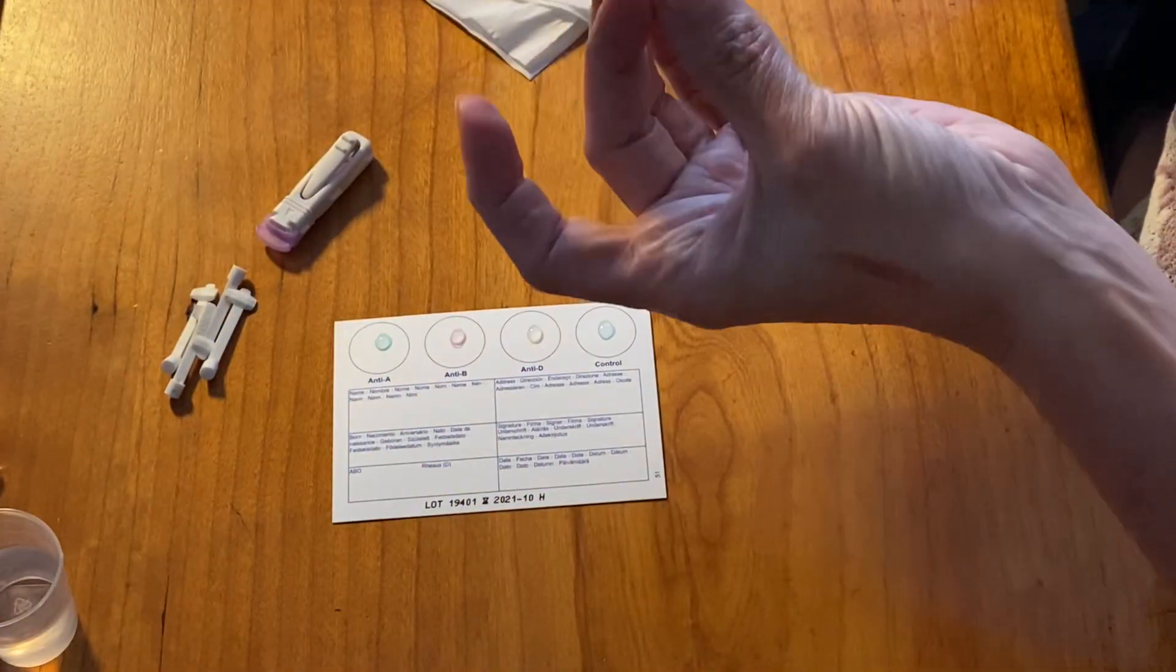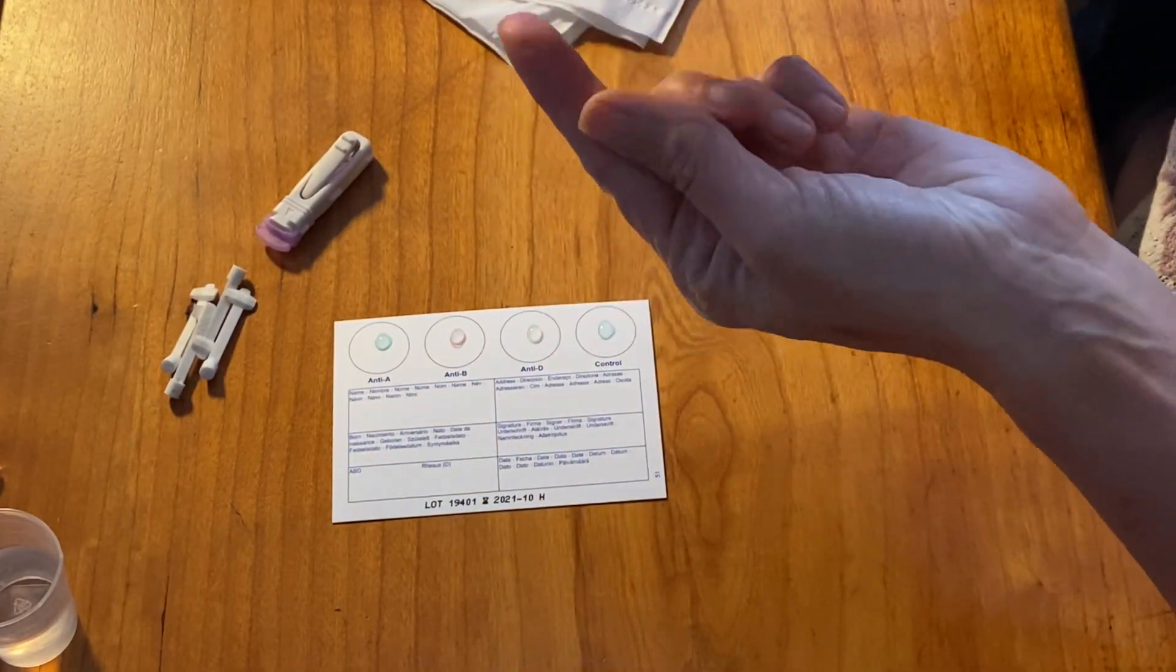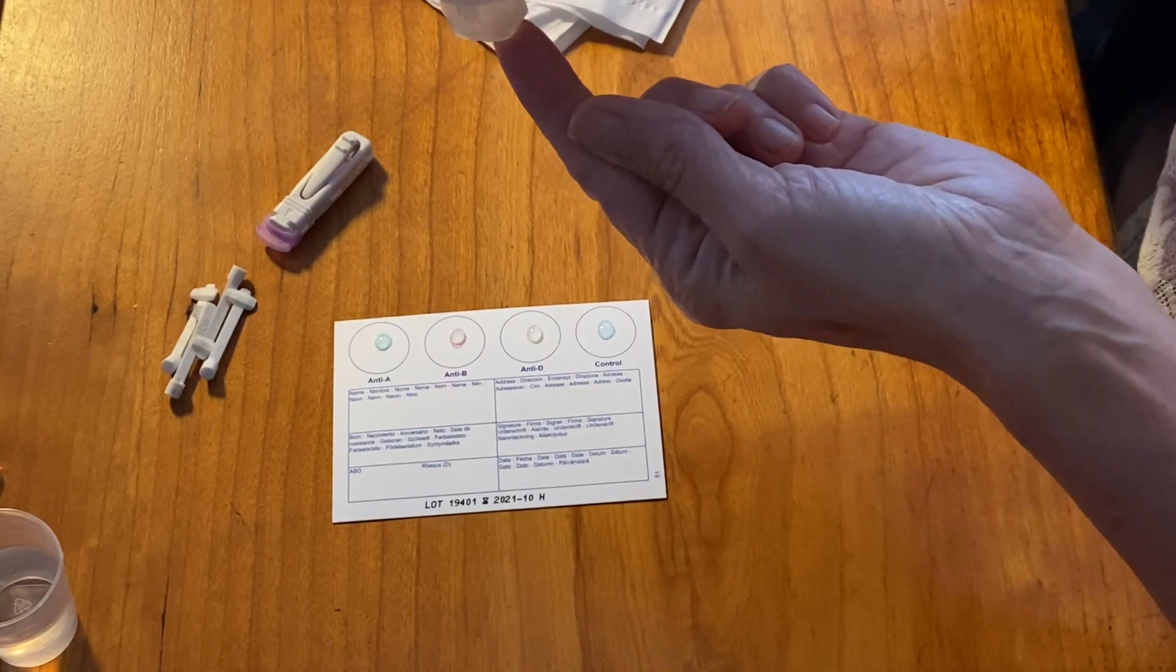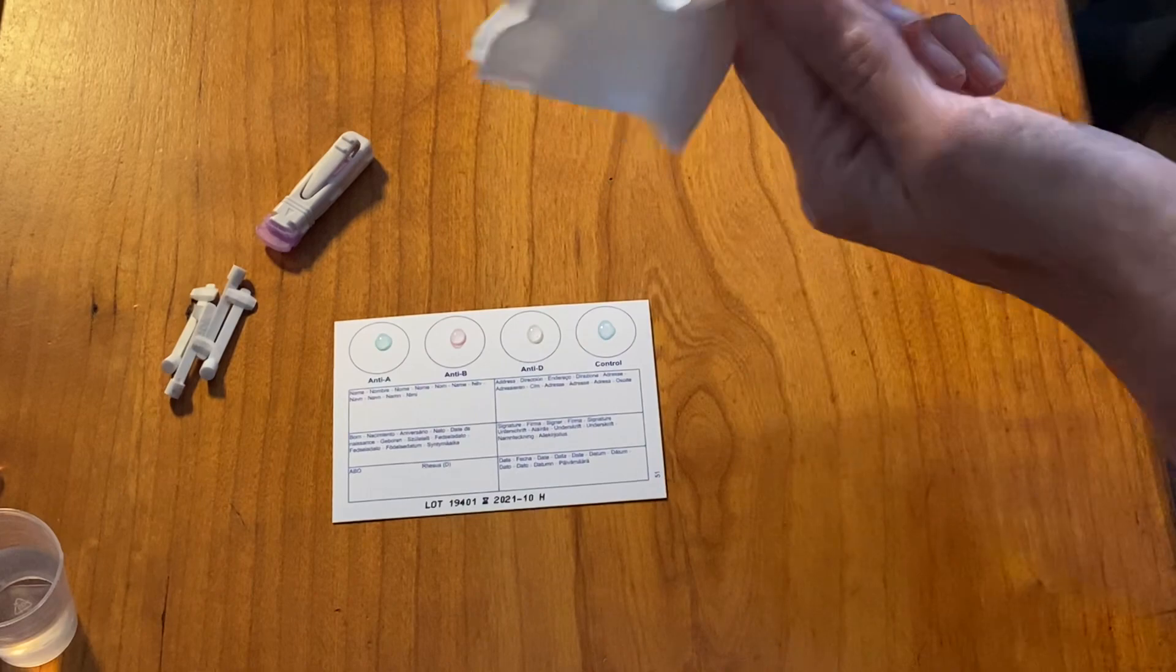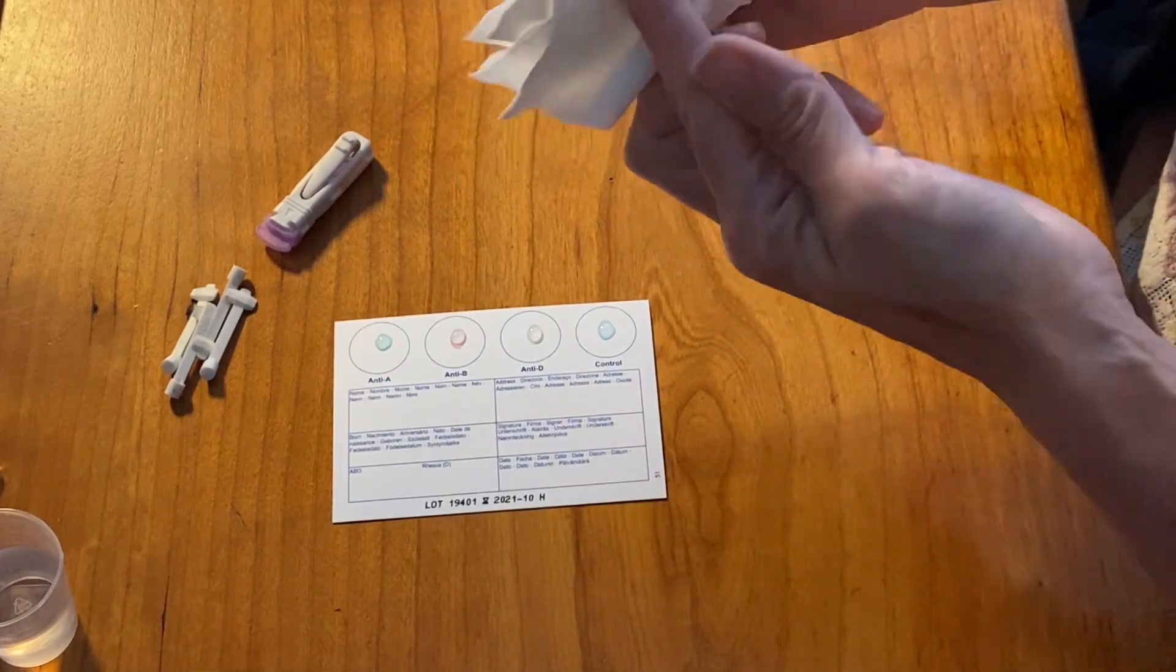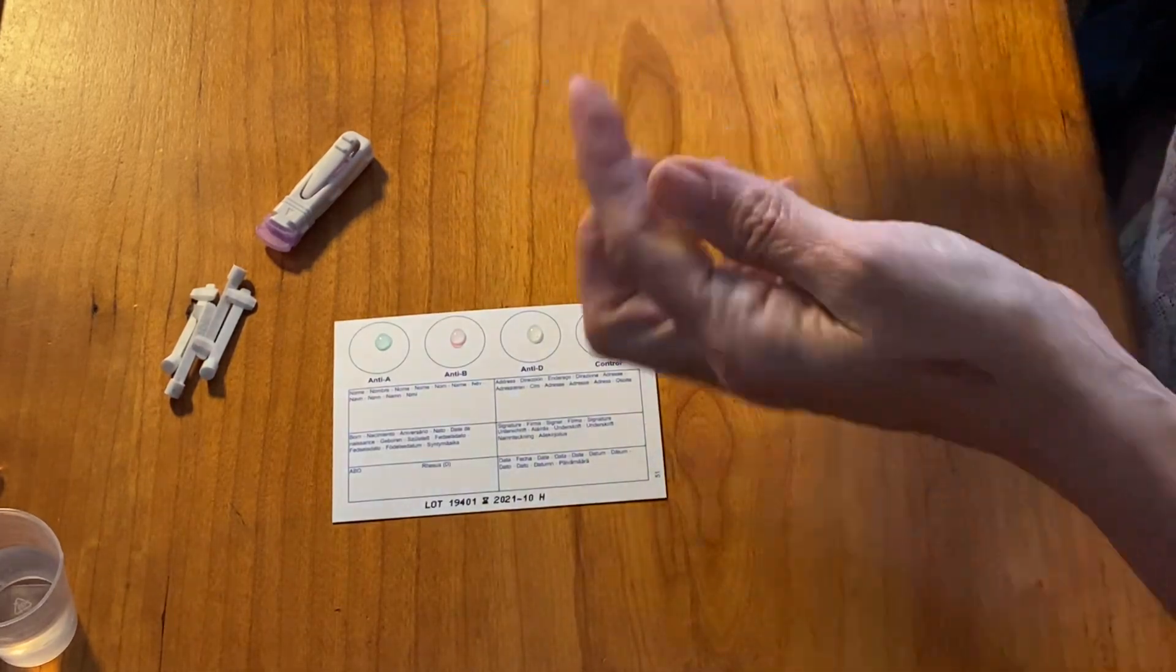Now we're going to cleanse the finger. I'll use this finger, doesn't really matter which. I'm using some hand sanitizer here. Clean off the excess. Make sure there's no alcohol left on the finger.